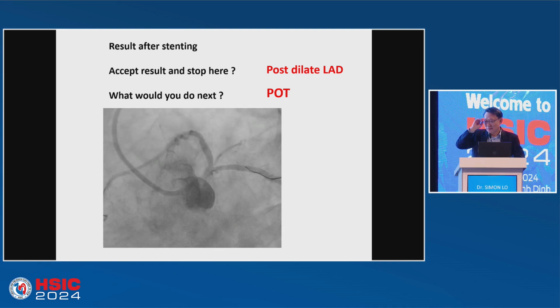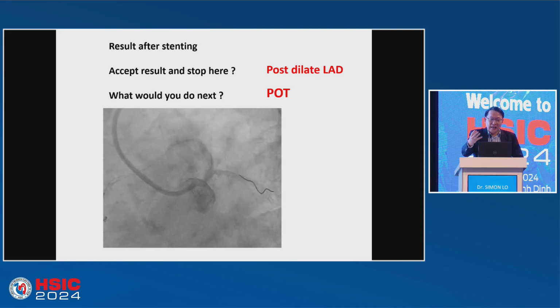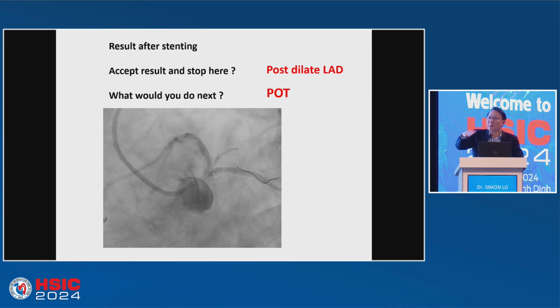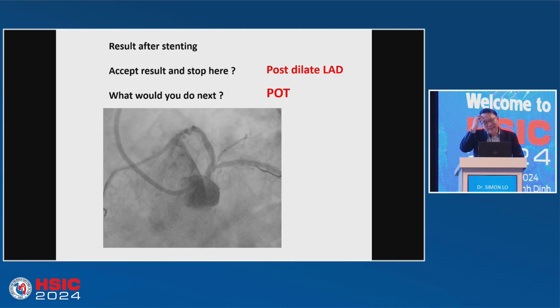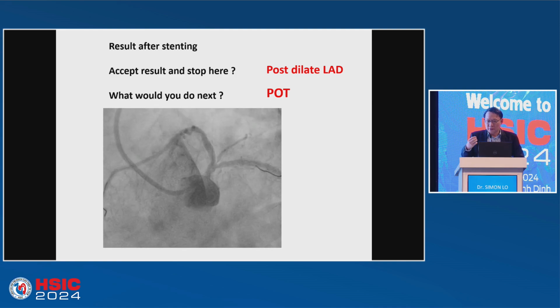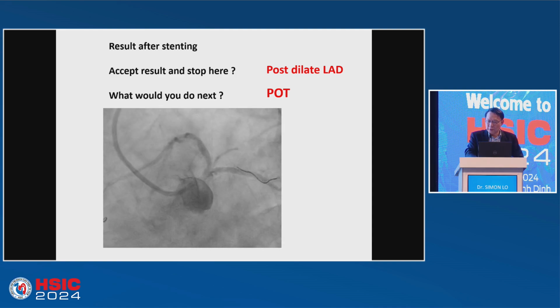Depends on the IVUS. If it's not good, then may do something. This IVUS thing, our friend there also said not everybody can afford an IVUS. In this case, we already have a deal in the beginning, we will keep the cost to the minimum. So I look at it, I use my eye instead of IVUS. I say, well, there is a problem there. It was very hard. Even the pre-dilatation showed recoil very fast. They must have some calcium and fibrotic tissues there. So I decided I have to post-dilate.